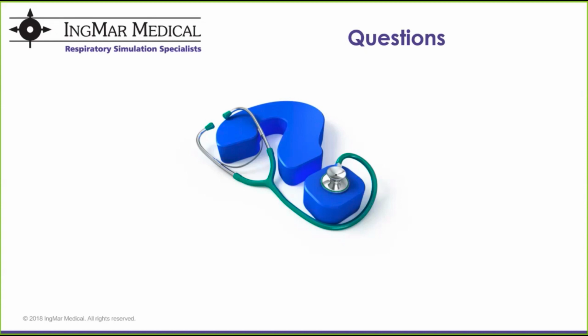Here's another question from Josephine. Would you give our team training if we purchased it? Yes, training is an option as well. Again, this conversation about what needs to be purchased as part of the system would primarily happen with your Laerdal representative. But we do have 2 different forms of training available.